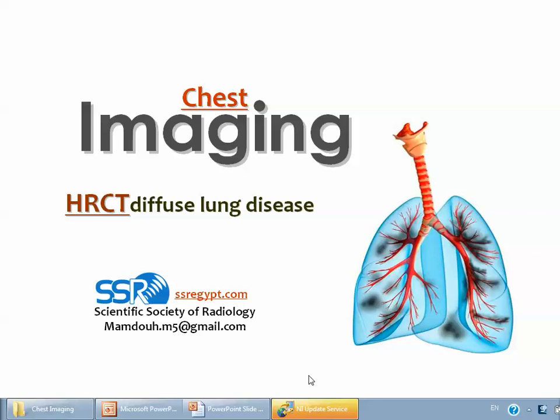Dear colleagues, this is a new lecture dealing with diagnosis of diffuse lung disease using the high resolution CT.